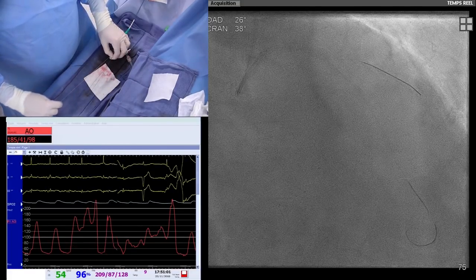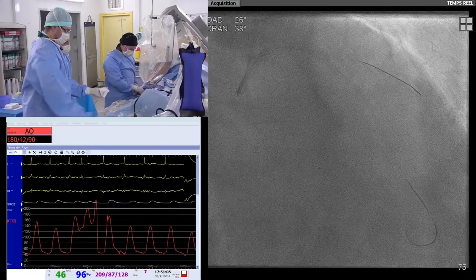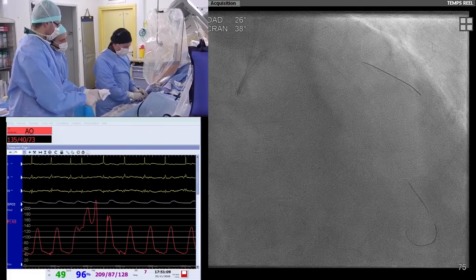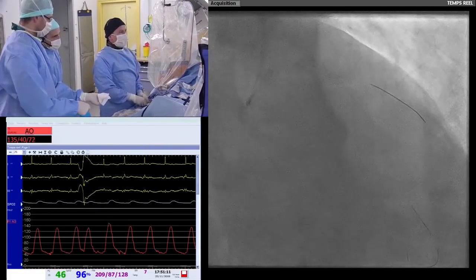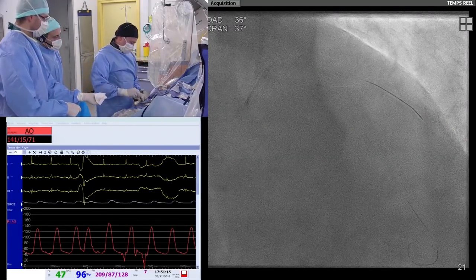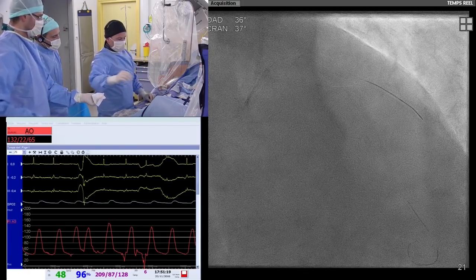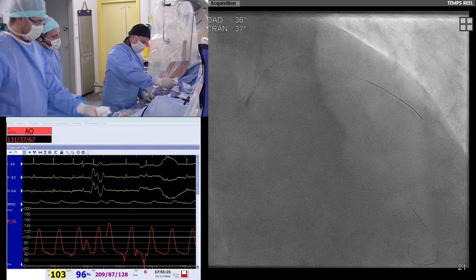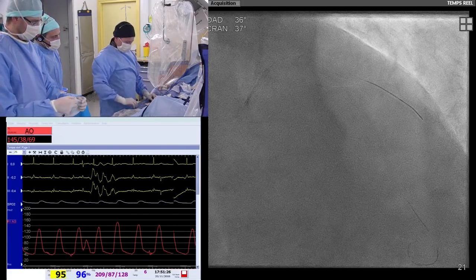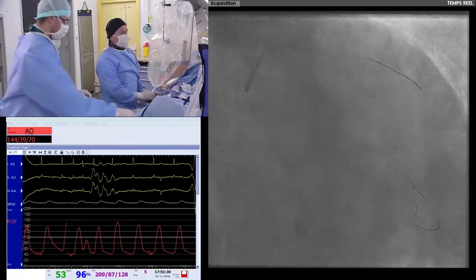I didn't inflate inside the left main. My strategy is to try to advance the stent in the distal part and to manage the left main after. Because if I perform any inflation in the left main, I should stent first the left main and the distal part. And the pressure is quite good at this time. So if you agree, I will do like this.